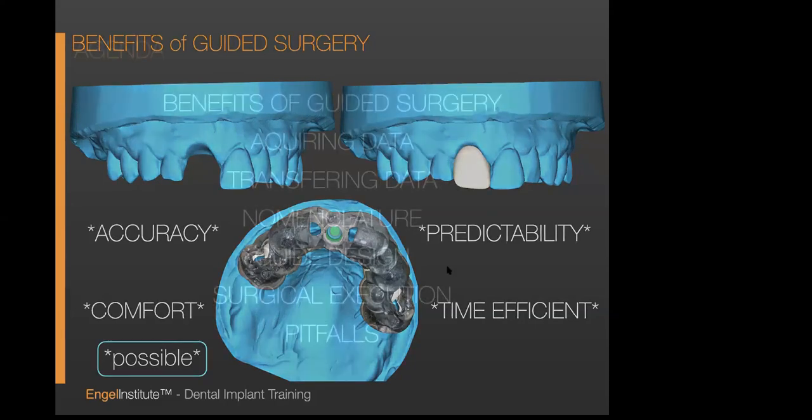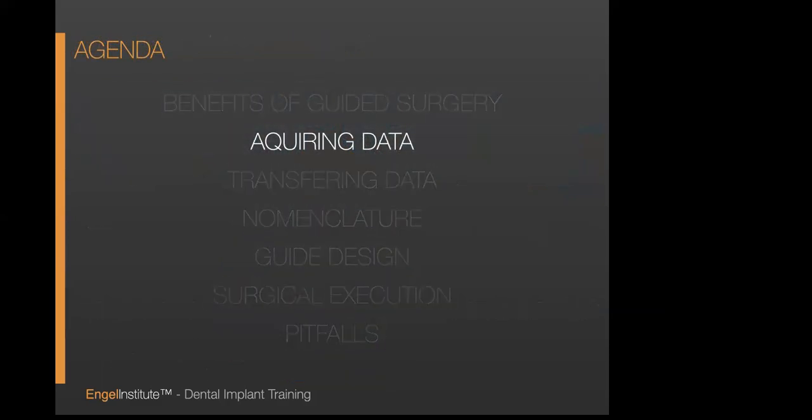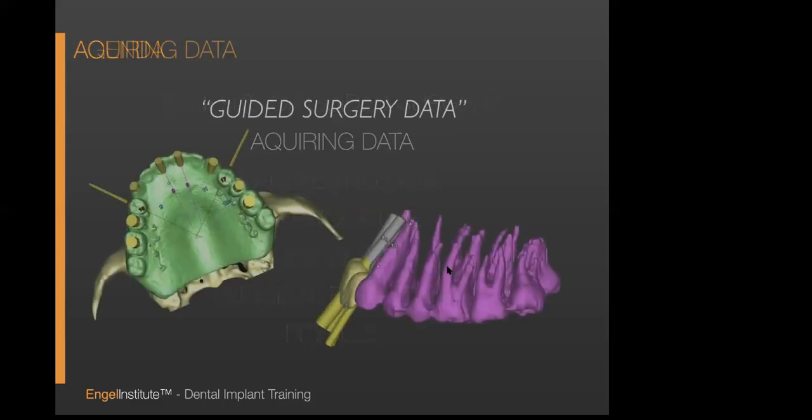Okay, so let's go ahead and look at acquiring data. Now, we do different types of guided surgery procedures, as we're going to get into, and they require a little bit of differentiation between the strategies. So let's look at that.